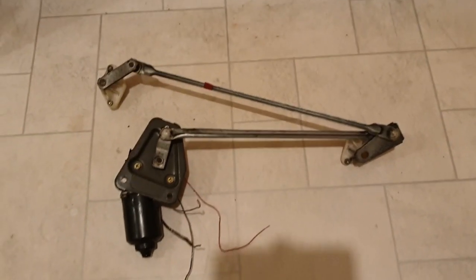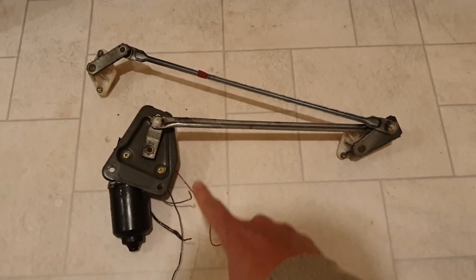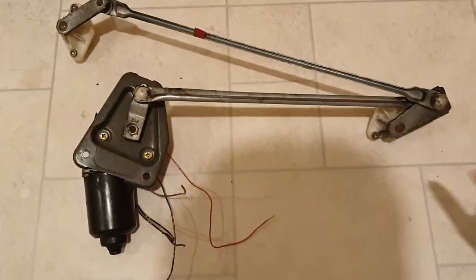When you purchase the wiper motor assembly, you'll notice it comes with a motor, a gearbox on top, a crank, a connecting rod, and two additional link bars. We don't need those — we'll remove them, as they're easy to pull apart.